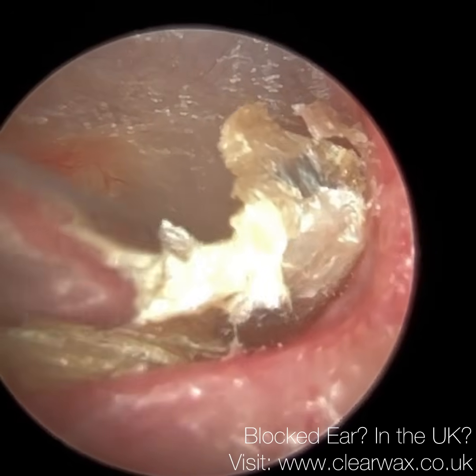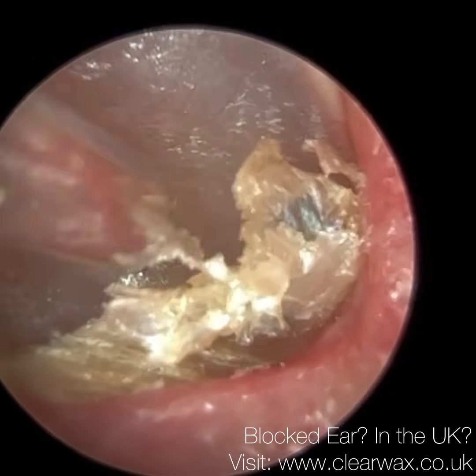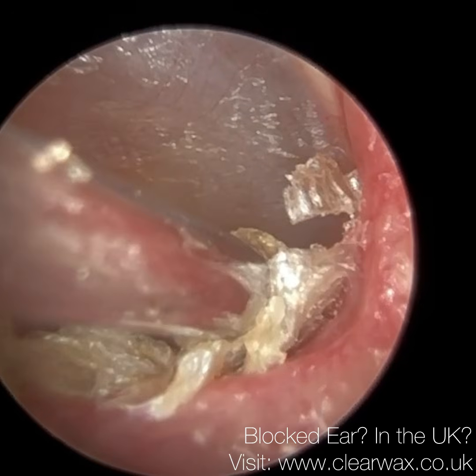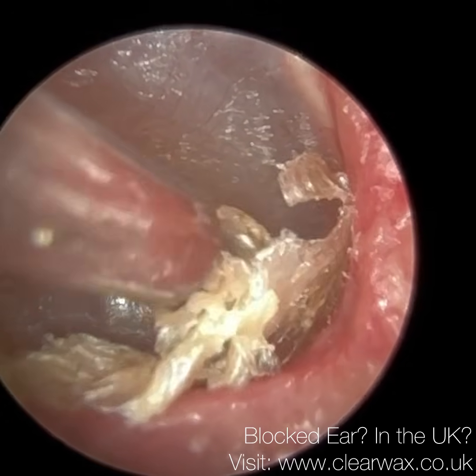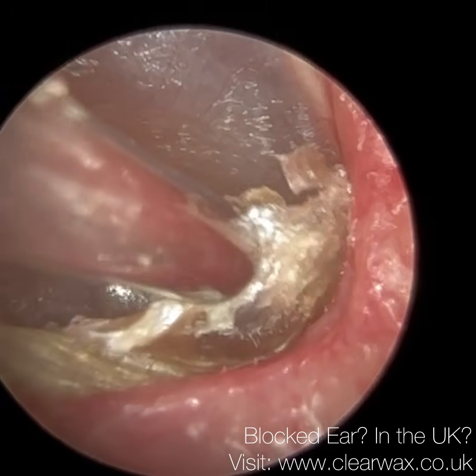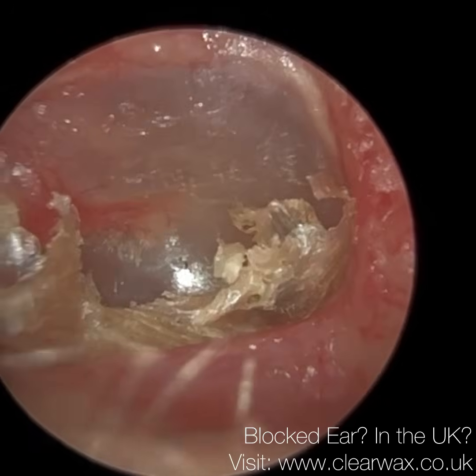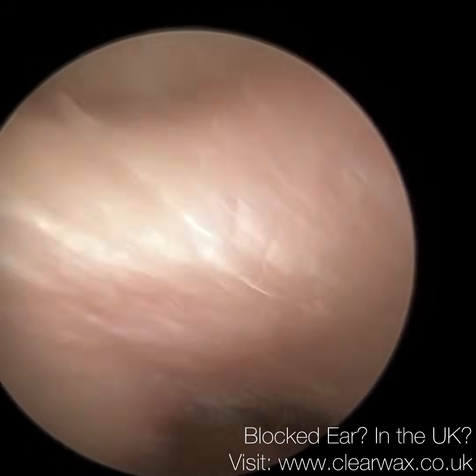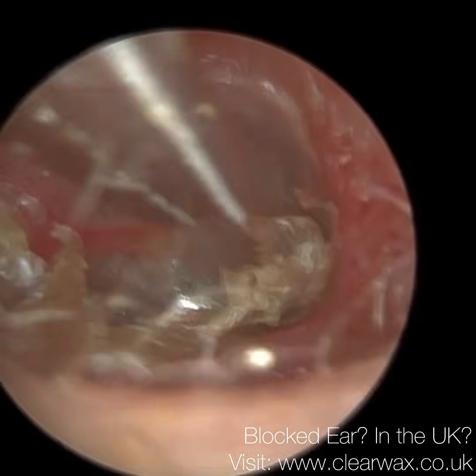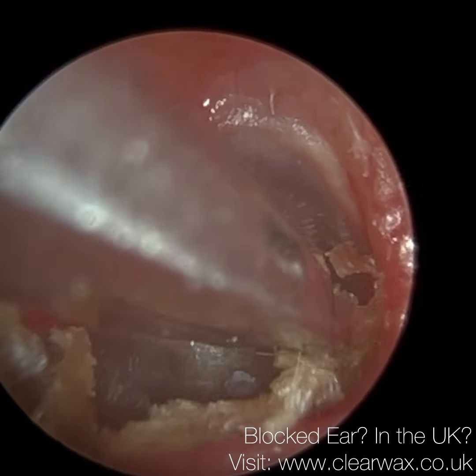I'm just going to lift it up. I did use forceps in the end. So whilst this patient's here, I'll clean as much as possible, and they've been coming on a regular basis, they're really comfortable with what we're doing, so it's worthwhile. And they travel a fair distance to visit me as well, so I just wanted to get as much out as possible, as safely as possible, so we're not going to get every little last speck out. So I think this is where I used the forceps. So you can see that huge widening. I have got patients with even larger widenings than this.